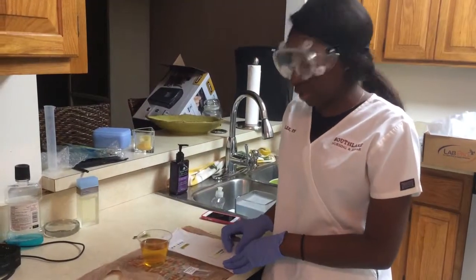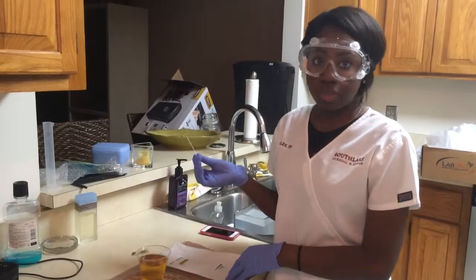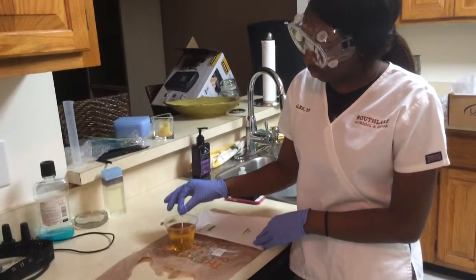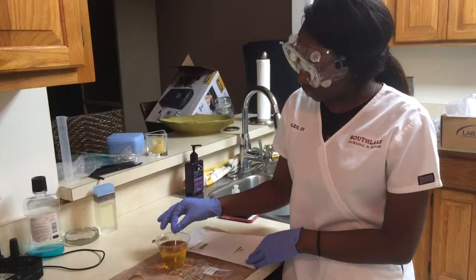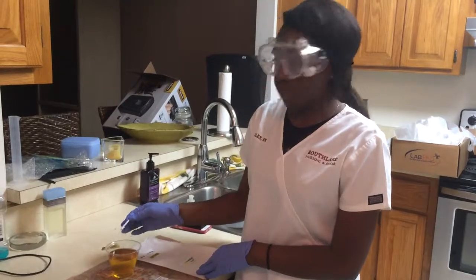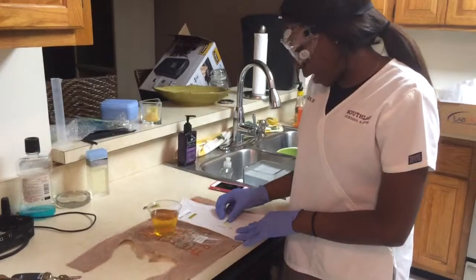Now I'm going to test for glucose and protein in my urine. I'll dip my test strip into my urine for about ten seconds, and I will compare to the glucose and protein guide that was given in our lab pack.